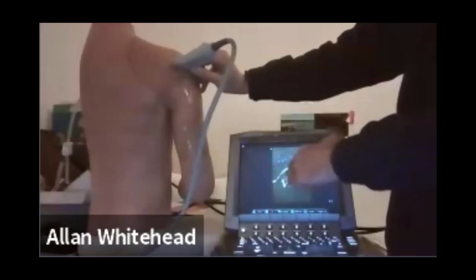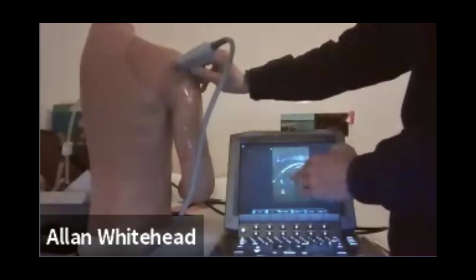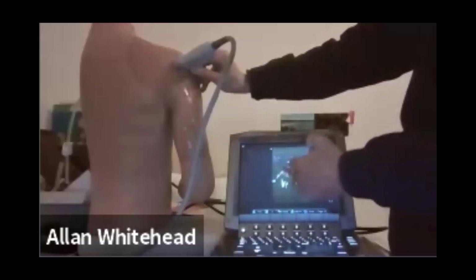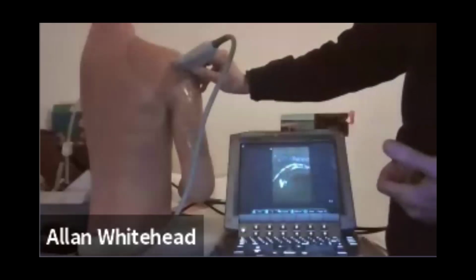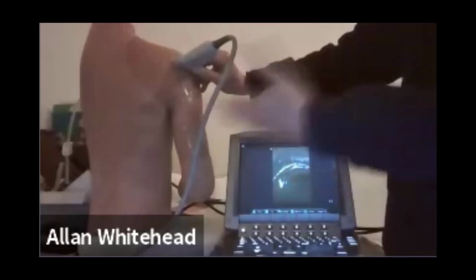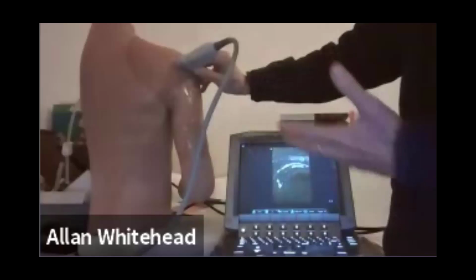In a dislocation situation with an anterior dislocation, the humeral head will be down here. And this would still be probably just within the normal range. It's a bit exaggerated, isn't it? It's almost a centimeter, probably just under. So it's borderline as to whether this would potentially be a posterior dislocation, because it's closer to the skin and closer to where you are with a probe posteriorly. What you'd do then is compare to the other shoulder, move the limb and see how well it's articulating with the shoulder. But up to a centimeter is normal.